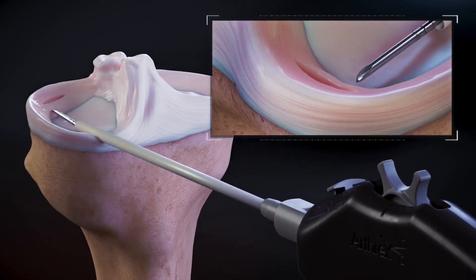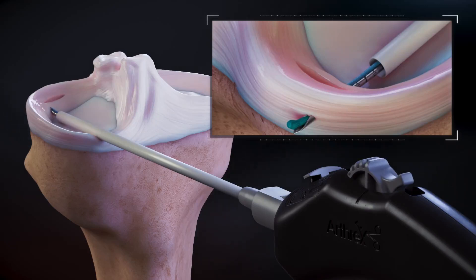Penetrate the tissue to the desired depth. Roll the deployment wheel backwards to the hard stop to deliver the first implant.